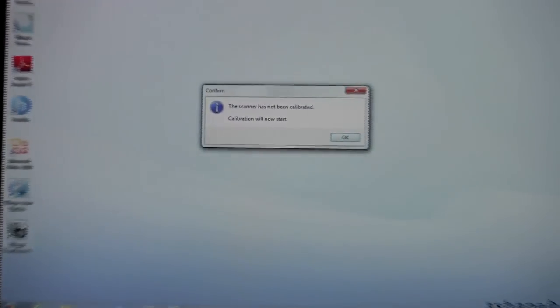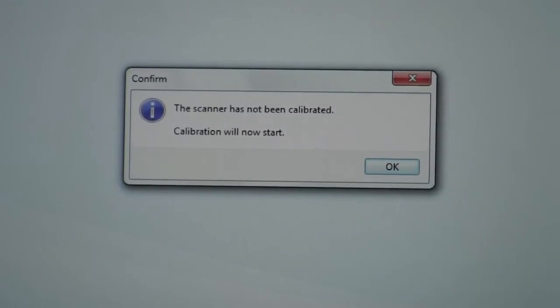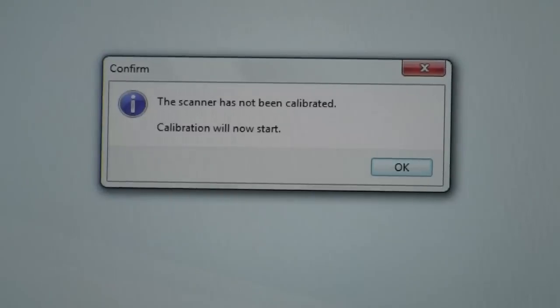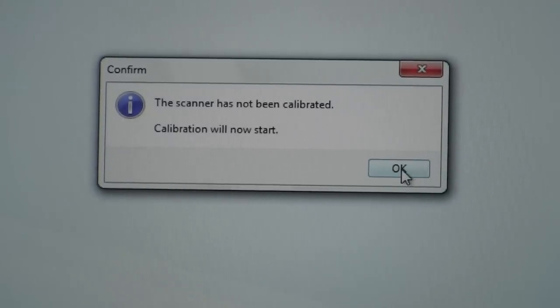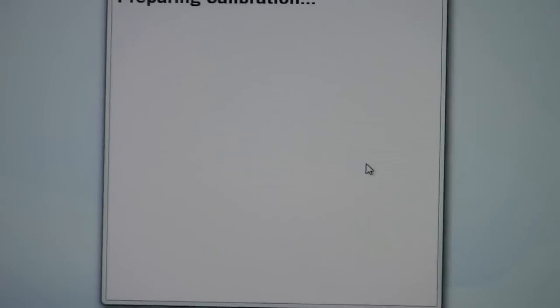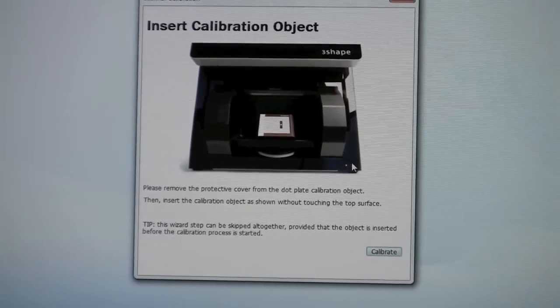Once the scanner is initialized, you're going to get a window in the center of your screen that says the scanner has not been calibrated, and that calibration will now start. We're going to simply click OK, and the scanner is going to move the scanning table and everything inside into the position needed for us to insert the calibration object.